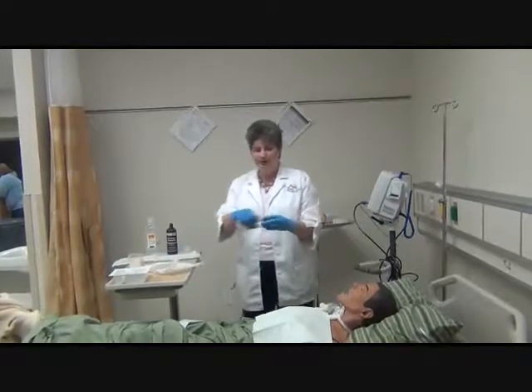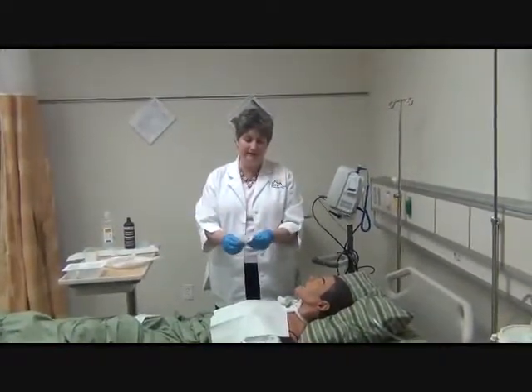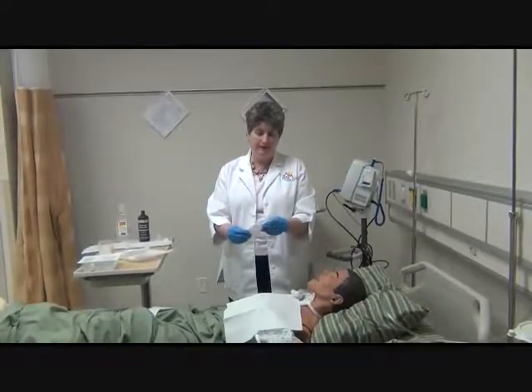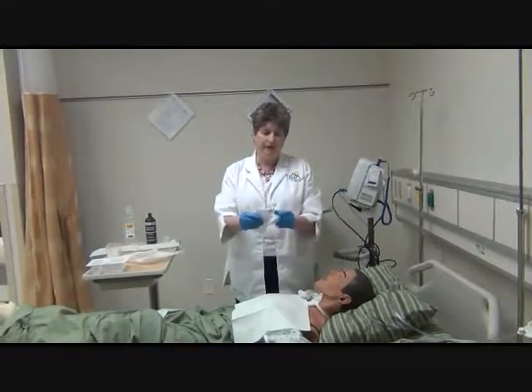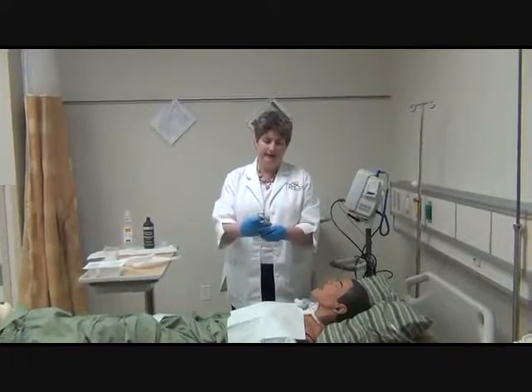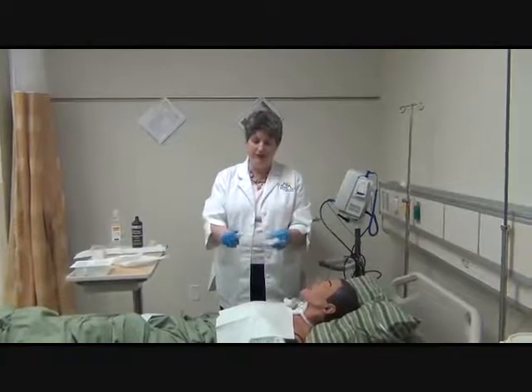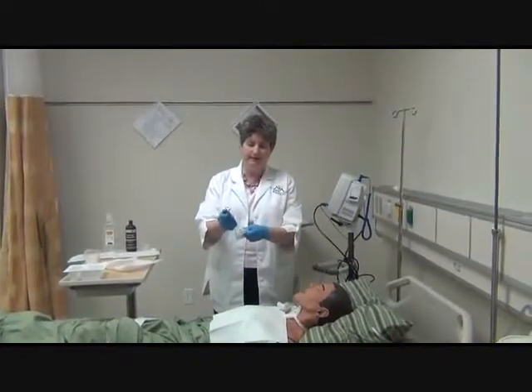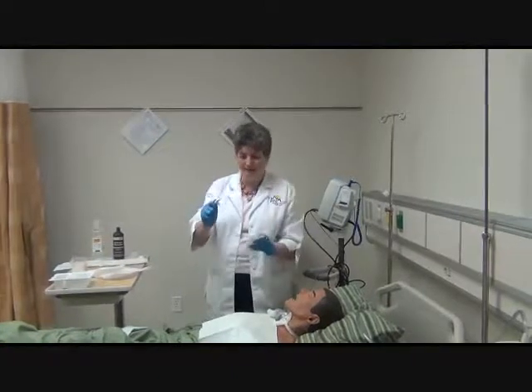Now, when I pull the catheter out of the kit, they usually have this sitting so that the part that's going to go into the suction hose is sticking out. I work that up so that it's sticking out, and then I bring the rest of the catheter out and make sure that this catheter tip is protected in my hand, because that's really the part that's going into the patient, and I want that to be kept sterile.